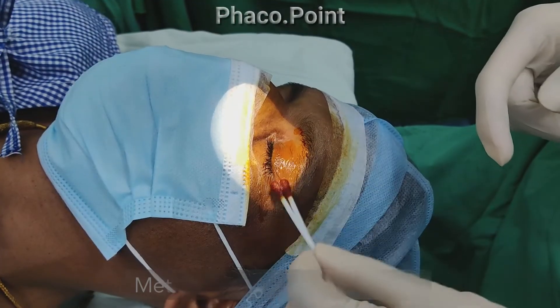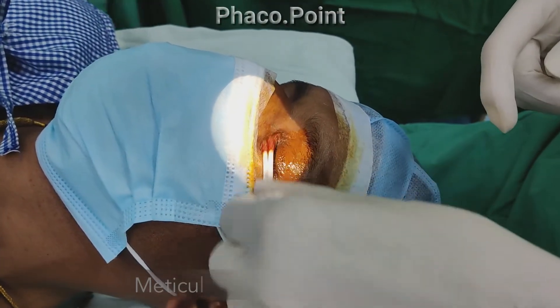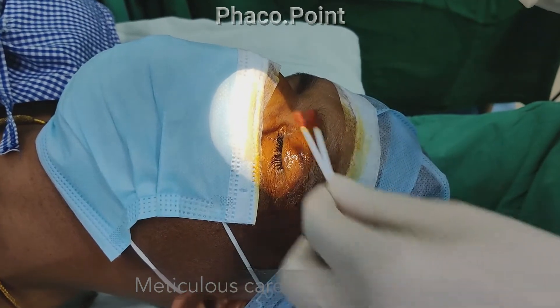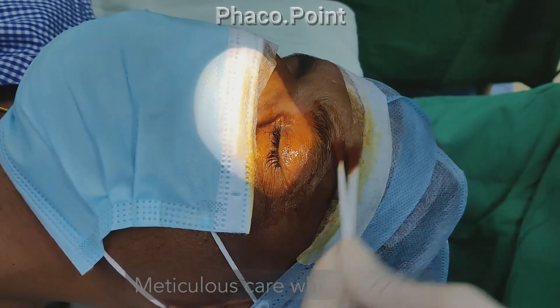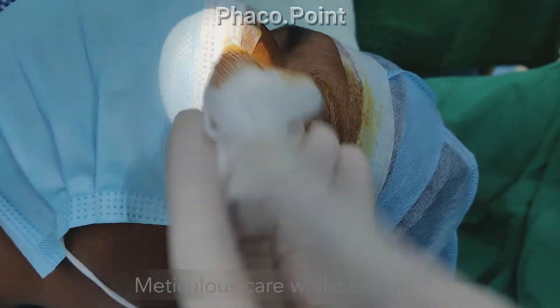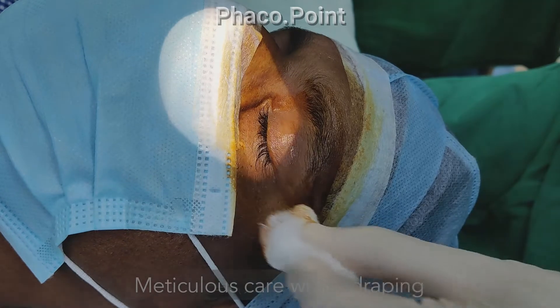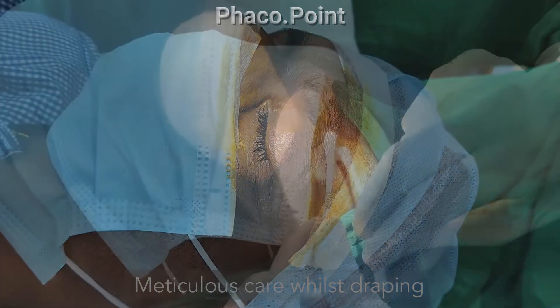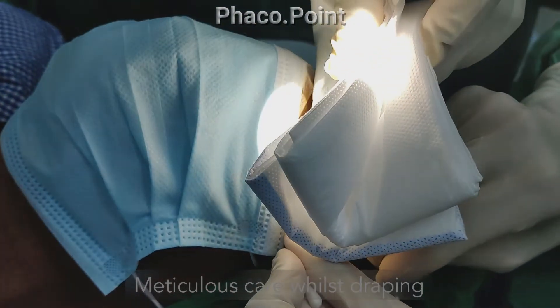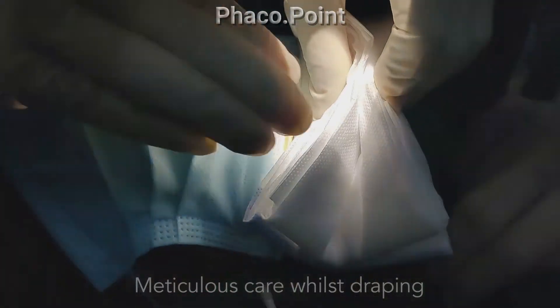The surgeon needs to be extremely careful before starting the surgery. Do not forget that you are dealing with a perforated cornea. So while preparing the operating field — that is, cleaning around the eye, as well as whilst draping and introducing the speculum — one needs to be extremely slow and cautious, always ensuring that it's done under direct visualization.